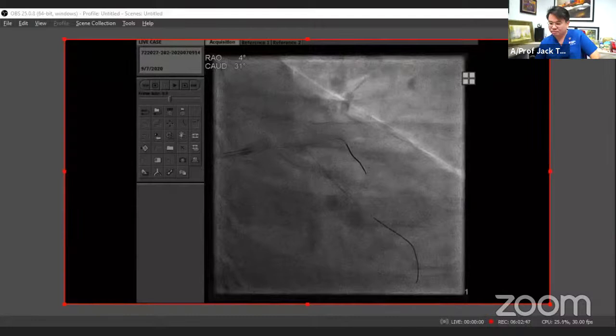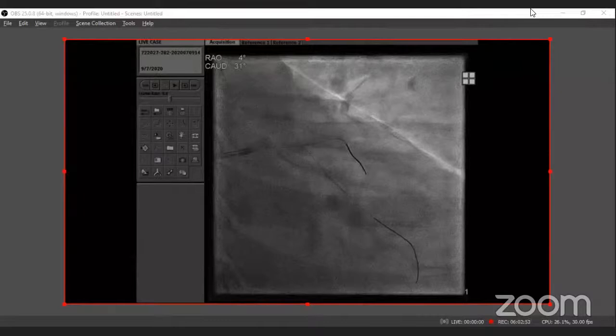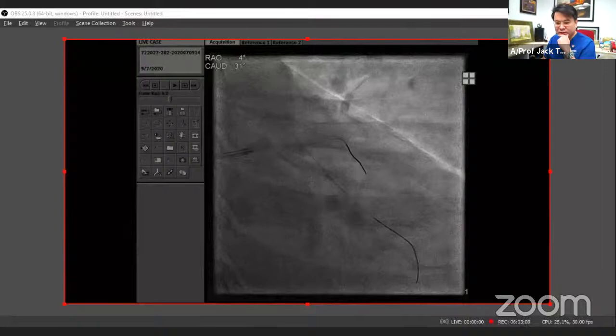Yes, actually, I would be most concerned about losing the side branch, right? Because the side branch is pretty tight, but there's also a distal left main lesion. So I think it's quite difficult to determine which one we will place more importance on in the initial part of the strategy. Yeah, so I hear a lot in this kind of workshop from the fellows that they're not confident in preserving a main and side branch, especially when you need to switch wires back and forth in the Culotte technique.